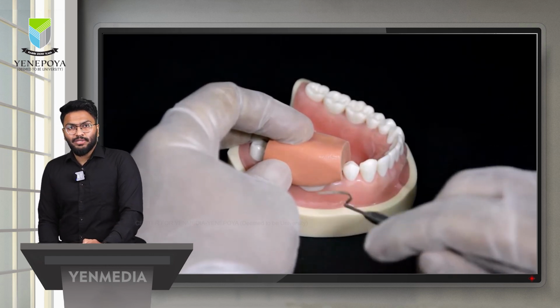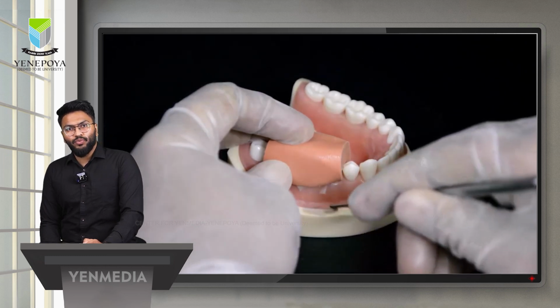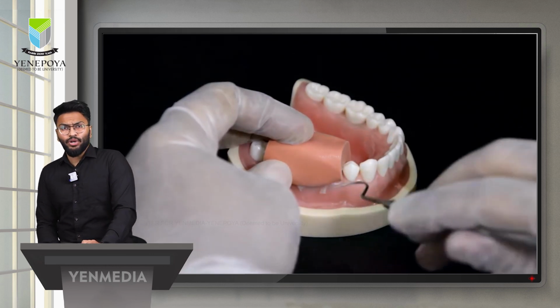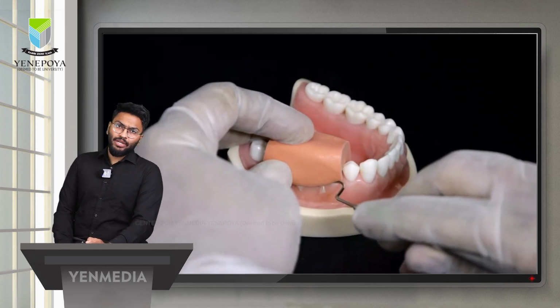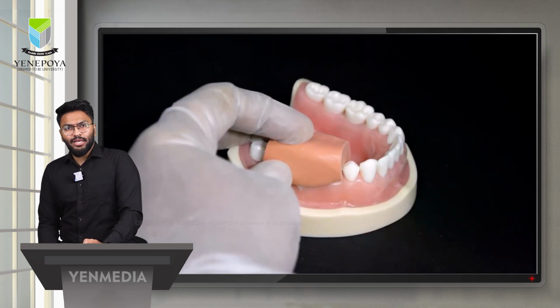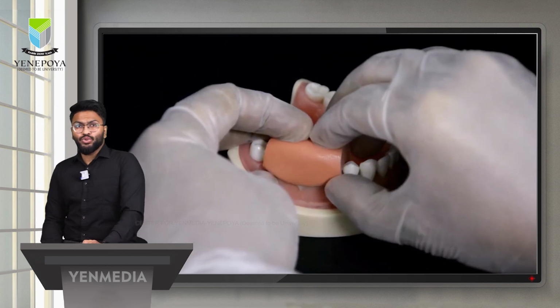Also, you can see some excess oozing out of the putty material. Make sure that you remove any excess which is coming out. You wait for around 2 to 3 minutes. Once you finish around 2 to 3 minutes, the material has finished its initial set. Once the initial set is complete, you're supposed to remove the putty index.